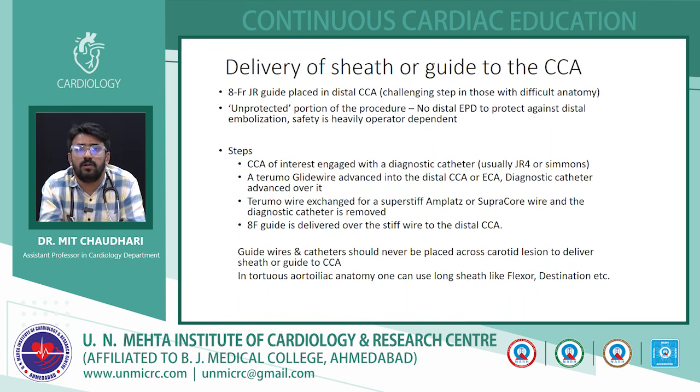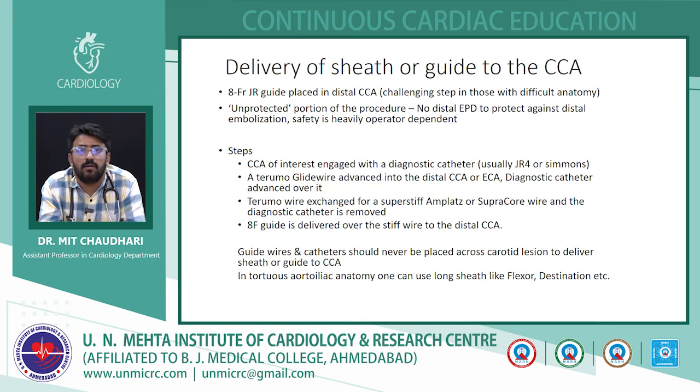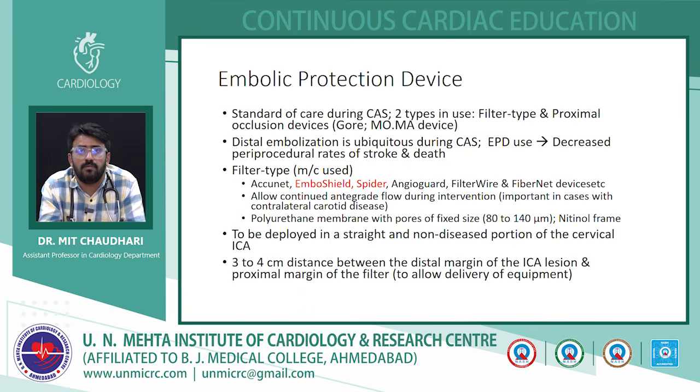In tortuous aortoiliac anatomy, one can consider a long sheath as well, like a Flexor long sheath or Destination sheath. Instead of using an 8 French guide, one can use this sheath, and we can perform the intervention through this sheath. After this, we will discuss some things about embolic protection devices.